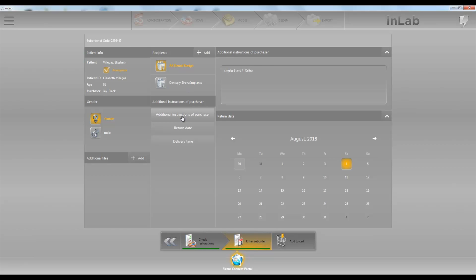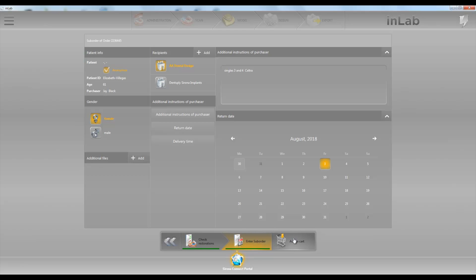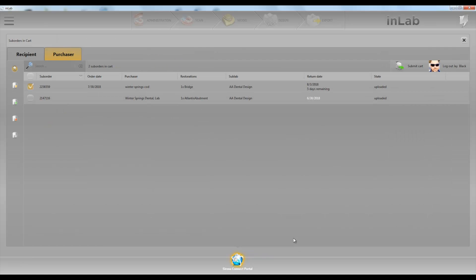Alright, and we'll go ahead and choose a date. We want it on August 3rd. We can add whatever files we want like pictures or anything like that. Then we'll add to cart and then we will submit cart.